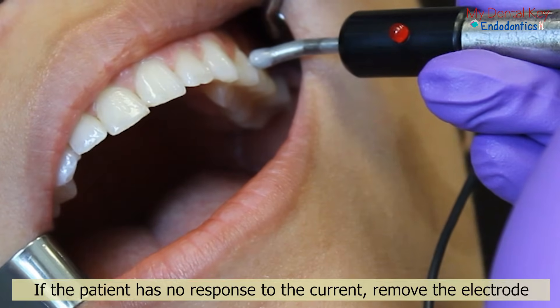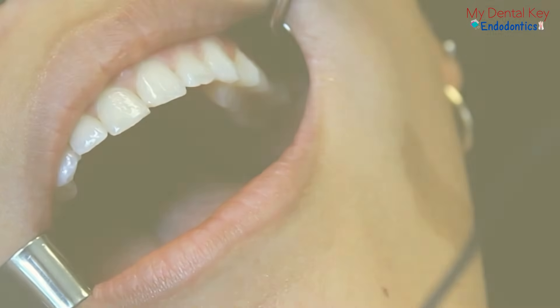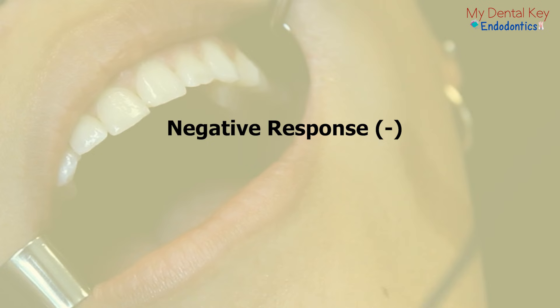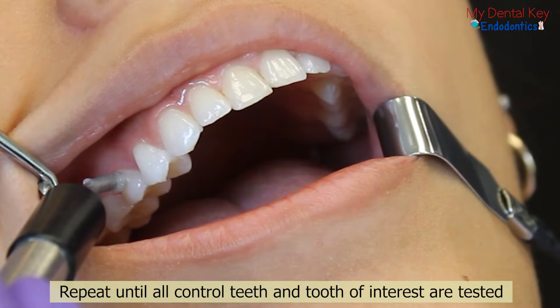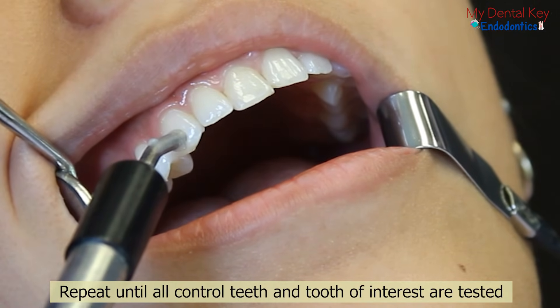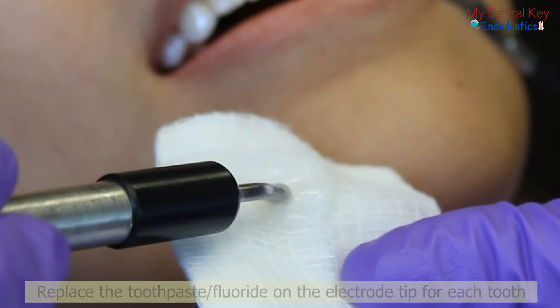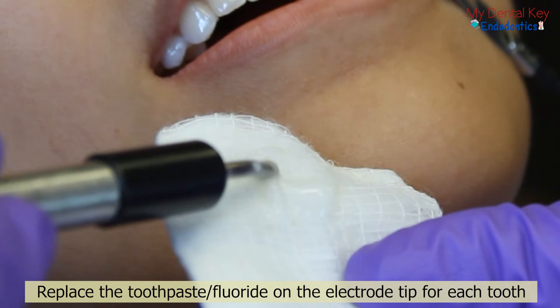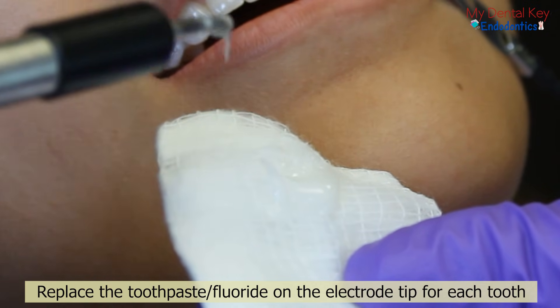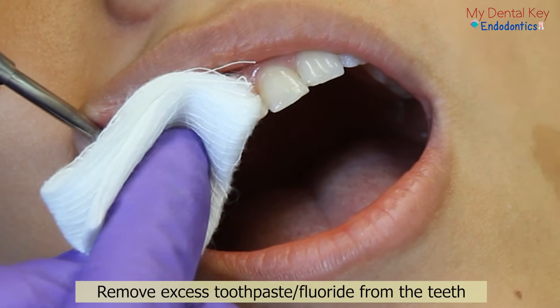If your patient has no response to the electric current, remove the electrode. This is a negative response and indicates that the pulp is most likely necrotic. Record the results in a record-keeping table. Repeat this test until all of the control teeth and the tooth of interest have been tested. You should replace the toothpaste or fluoride gel onto the tip of the electrode prior to testing each tooth. At the end, remove any excess toothpaste or fluoride gel from the teeth.